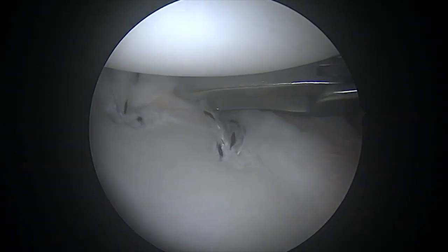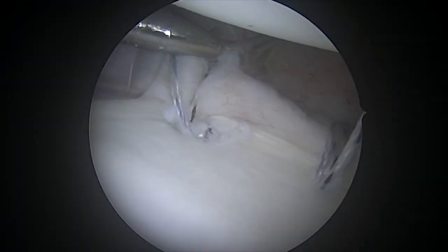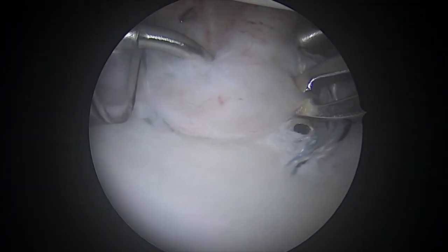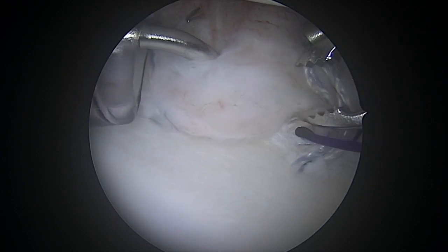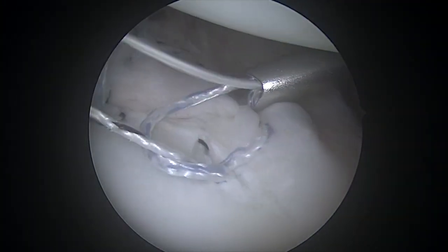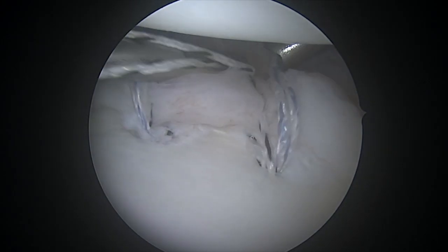As we're working here, I'm trying to get all of that inferior capsule to translate all the way up, and that will tighten the shoulder for us. The same process here — you want to make sure that only the sutures you're tying are coming out of the cannula you're tying through. That can really avoid problems with the sutures becoming tangled.